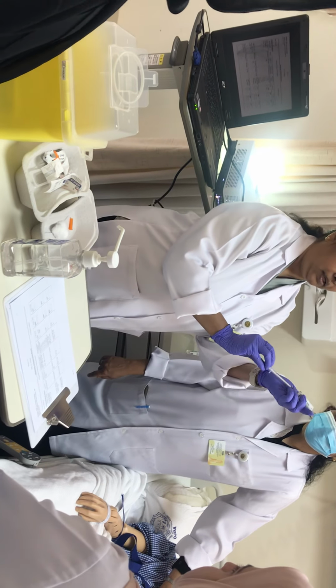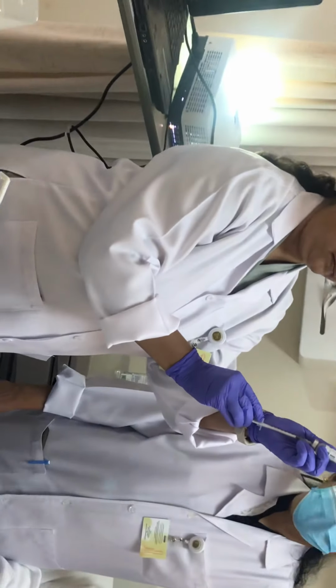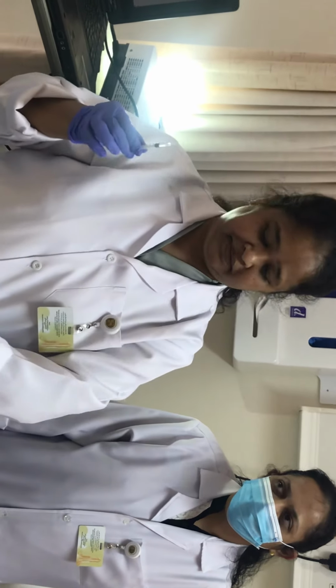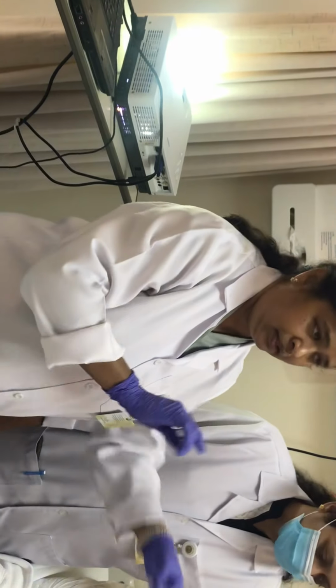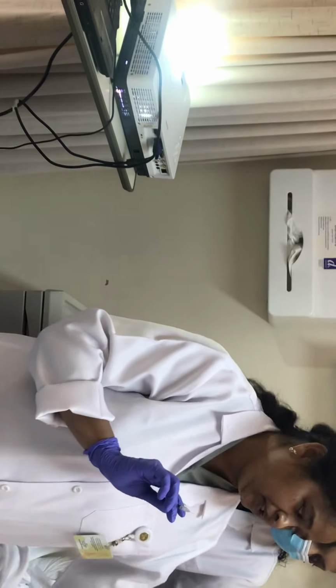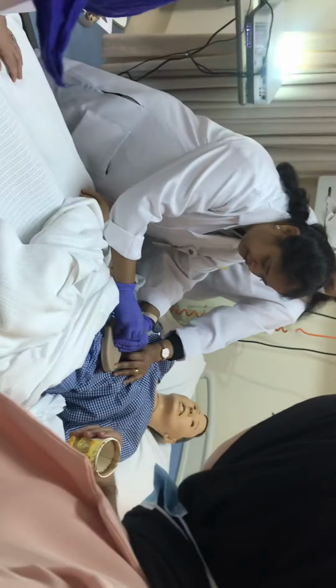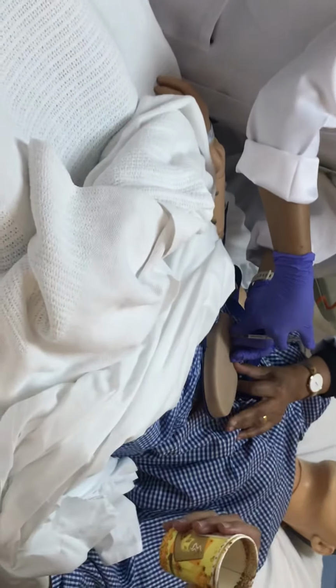Okay, take only 10. In the sense, total should be 20, without 20 you cannot do anything. Very tricky. That's why we give this for the third exam. Check again. Okay, now is the third check. Then you have already cleaned, you imagine. And 90 degree we are going to give, but still pinching is needed. Pinch, give a 90, hold the syringe, then give medications.